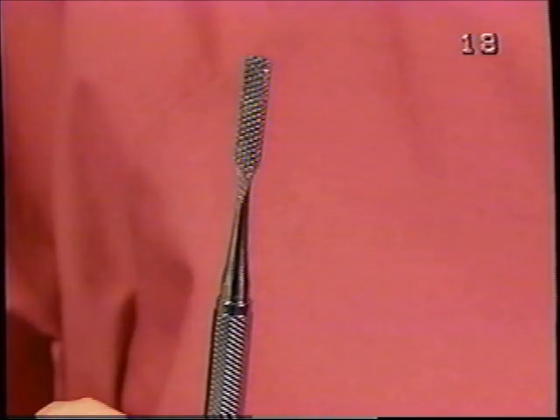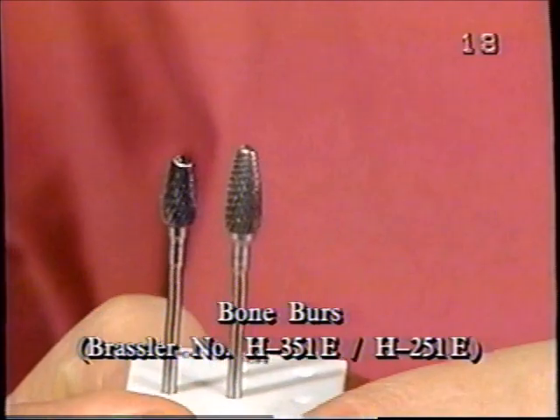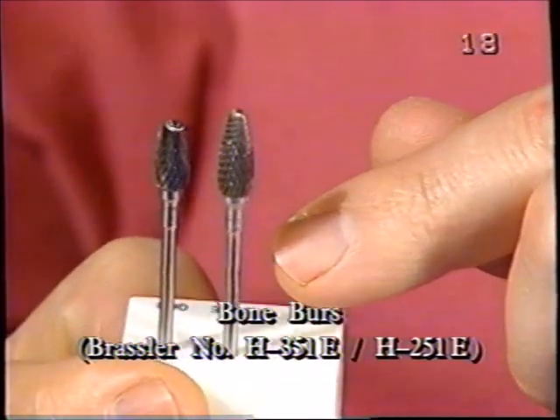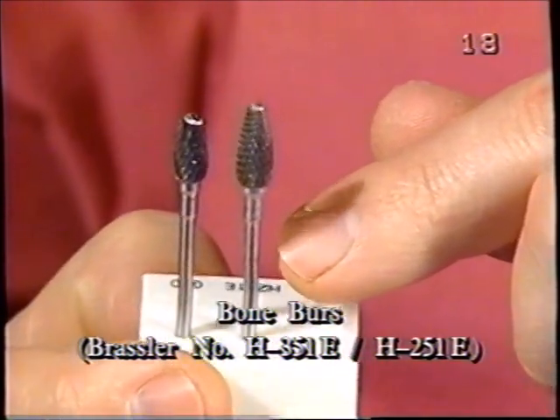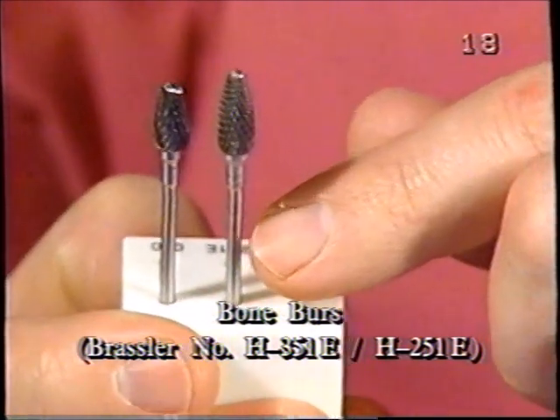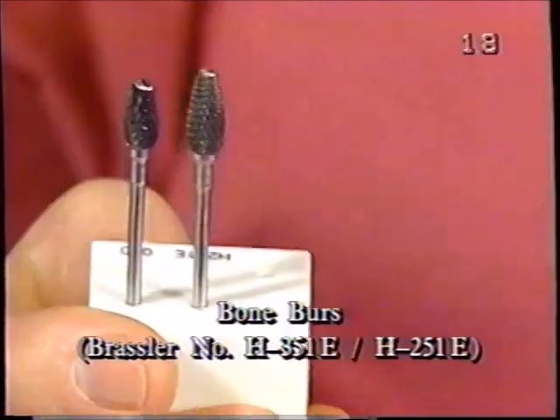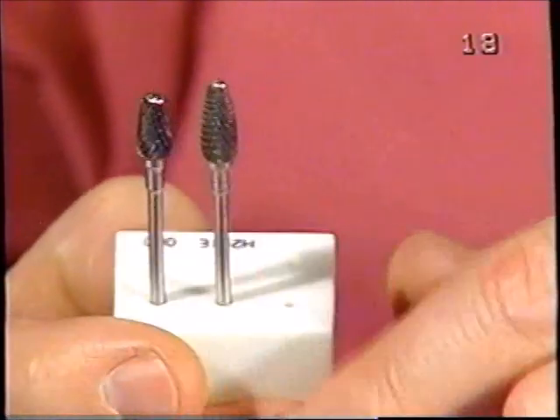I'll hold up these 2 bone burrs by Brasler. The one I'm pointing to right here is an H251E for use with a straight handpiece, and an H351E over here, a little bit smaller.